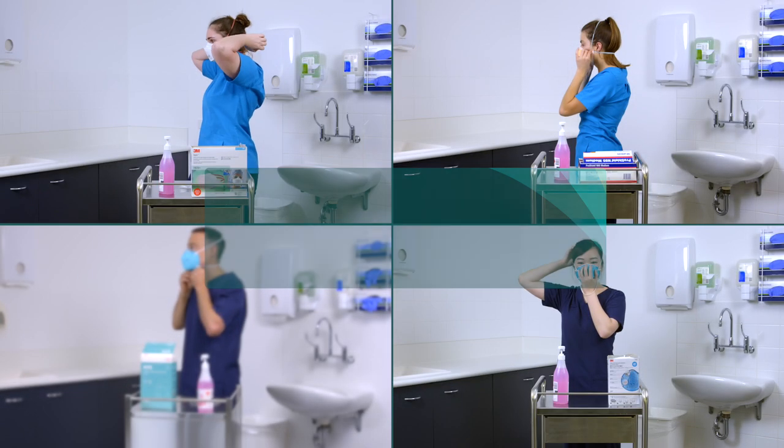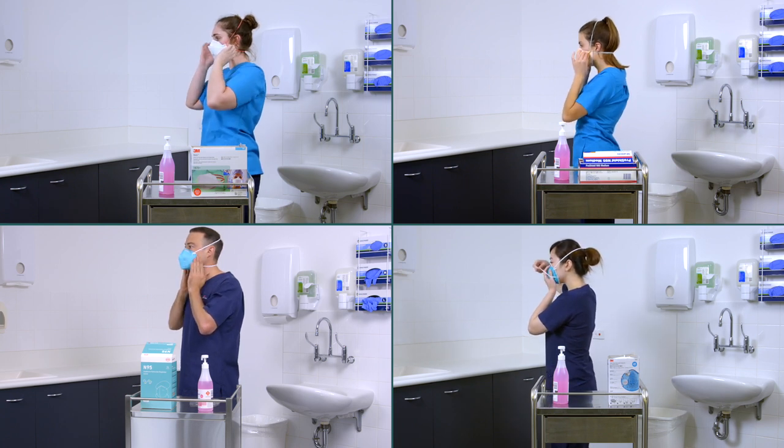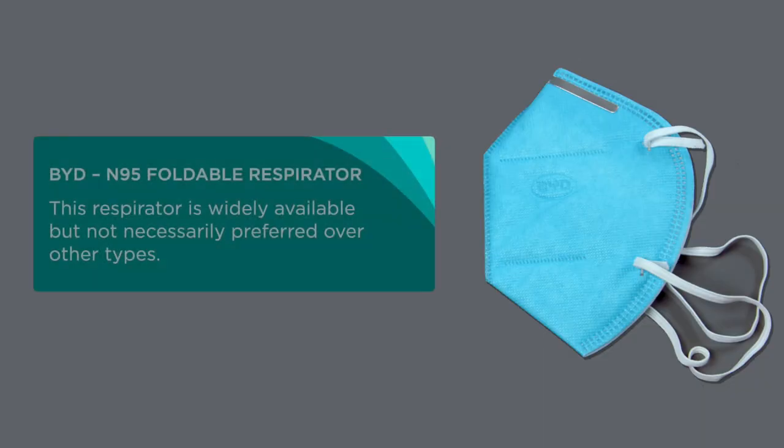There are several types of P2 or N95 respirators available in NSW healthcare settings that are provided by HealthShare NSW. This respirator is widely available but not necessarily preferred over other types.